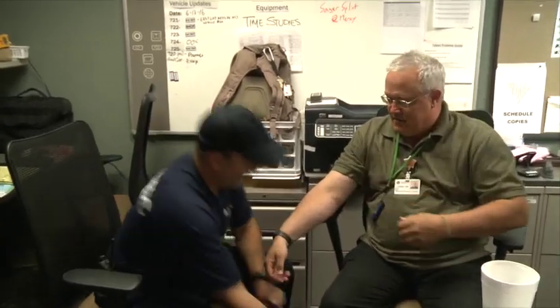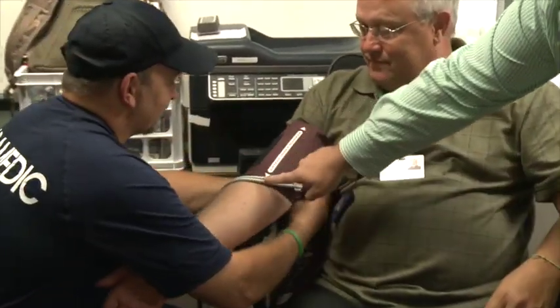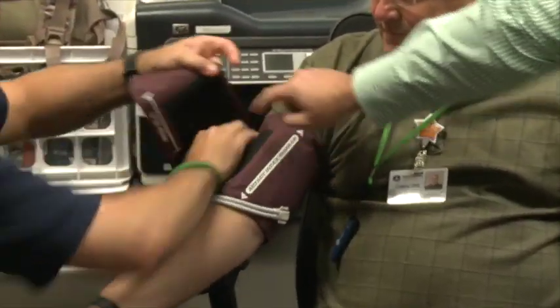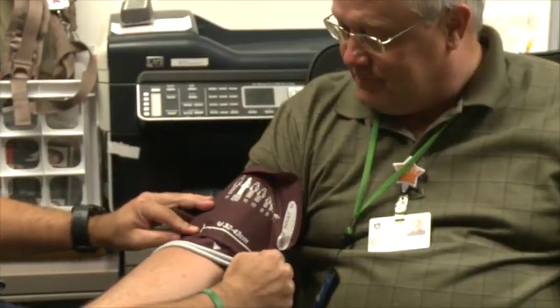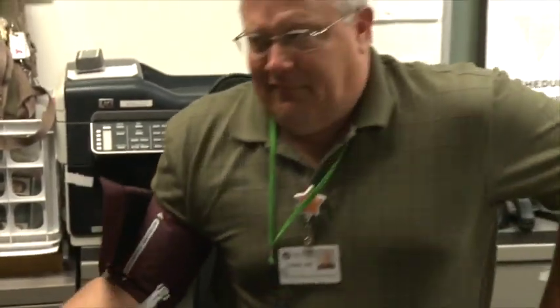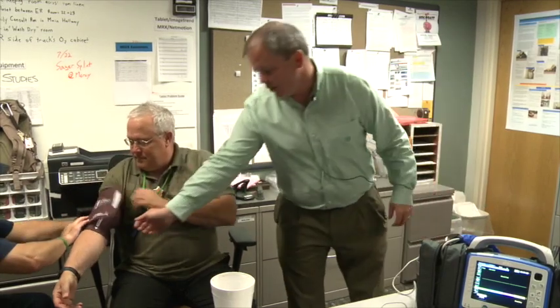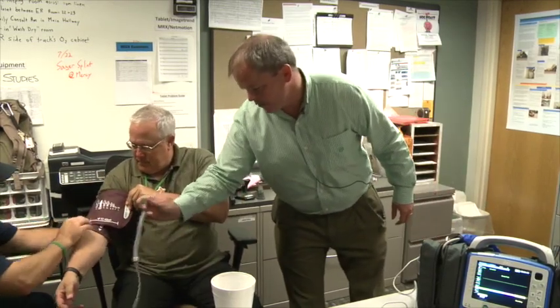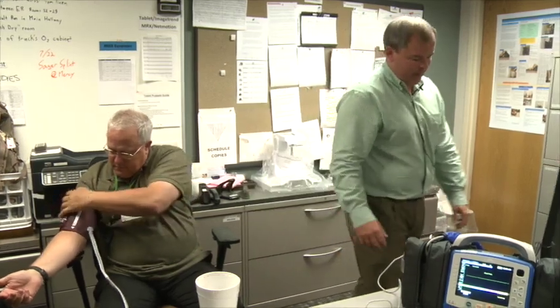We want to make sure we're using a correctly sized cuff. The cuff is correctly sized when the artery index marker is over our artery and that marker falls within the range indicated by the two white lines. There are four cuff sizes included with the X-Series today. If you feel you need additional sizes, let us know — there are 16 sizes available. There is no reason not to use the correct size cuff; it is very easy to clip on and clip off to adjust.